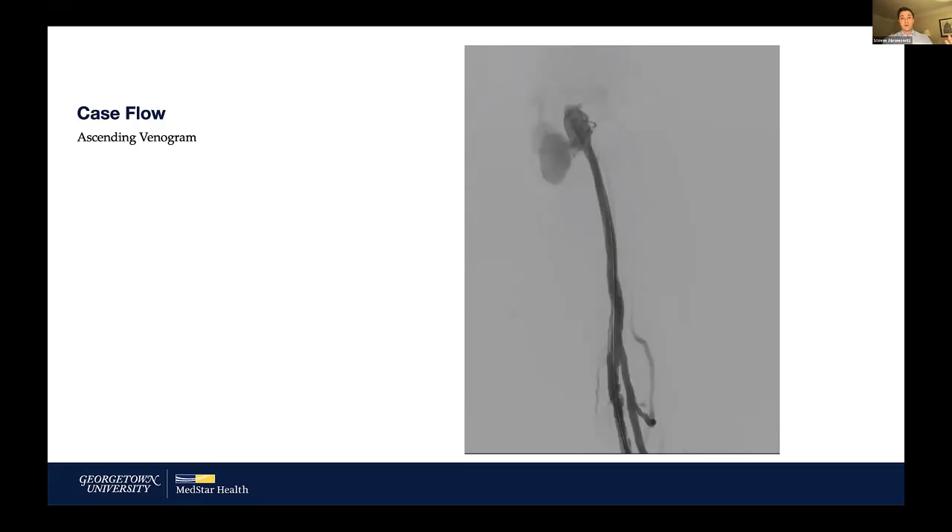The first part of a RevCore case is popliteal access or antegrade access to perform the RevCore procedure. I found it efficacious to get the access you're going to use to cross first, because before opening all the devices and spending all that money, you want to make sure you actually cross the lesion and give yourself a chance to have a successful outcome.